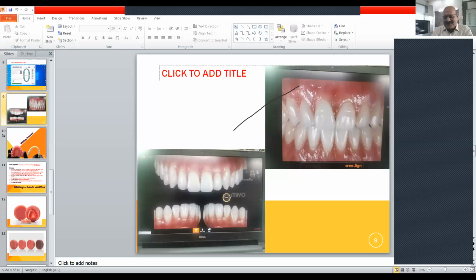In such a situation, at times after a year, when the resorption settles down, wherever the extraction was, the maxillary or mandibular denture becomes a bit loose. And when the patient is paying so much, the patient would not want the doctor to say it cannot be relined, you need to get a new one made. So I am not doubting the capabilities of PEEK, but we should know that it has its own indications and should not be considered that you use it and everything would be good.